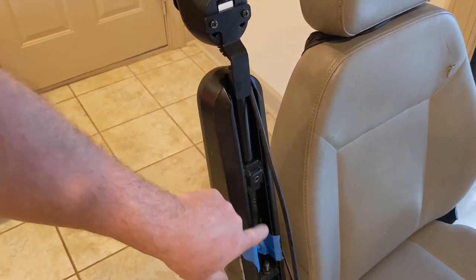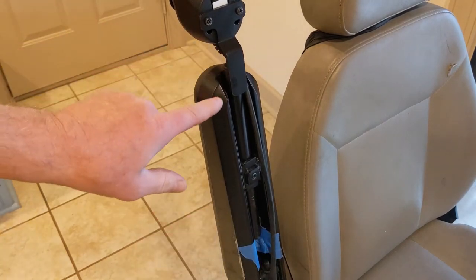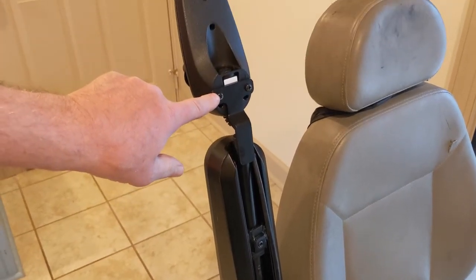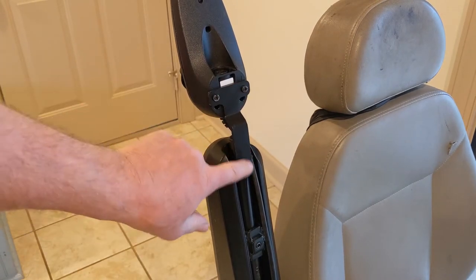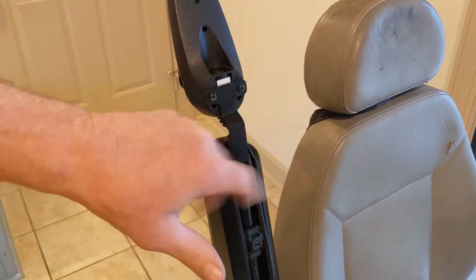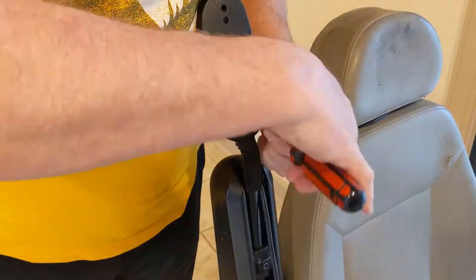If you raise the arm up there's an Allen screw used to tighten down this rod, and in my case there are two Phillips screws. I'm going to remove these Phillips screws and leave the rod in place to get it out of the way. Now I've got the joystick assembly here on the bench and I'm going to be taking it apart.